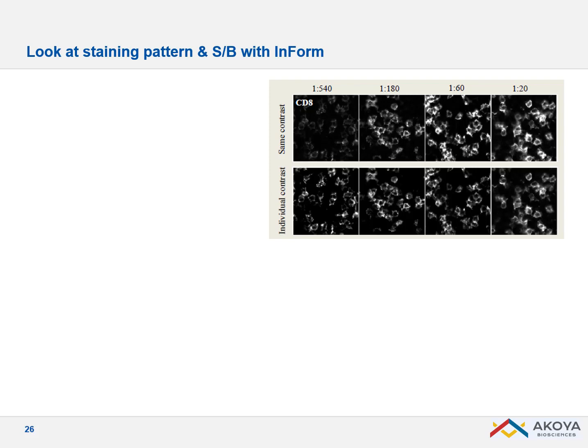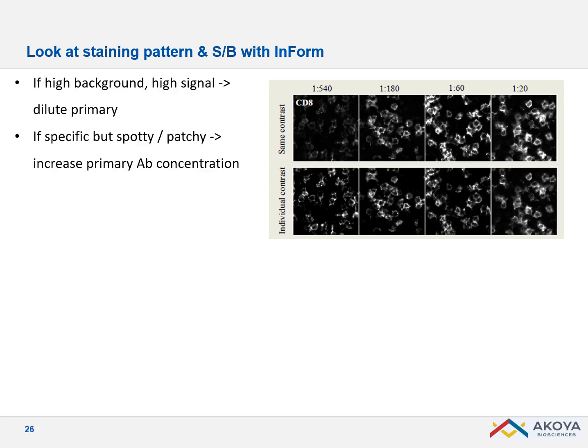The first thing to look at is the staining pattern. For example with CD8, which is a membrane staining, you want a nice ring and well-saturated antigens. If it becomes spotty or patchy, you've diluted too far and need to concentrate more. Conversely, if the signal is really chunky or very high, you know you have room for further dilution.